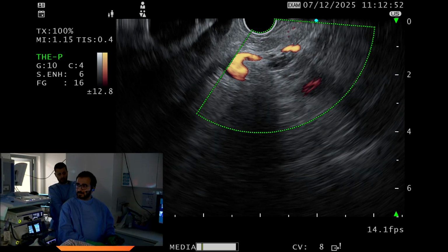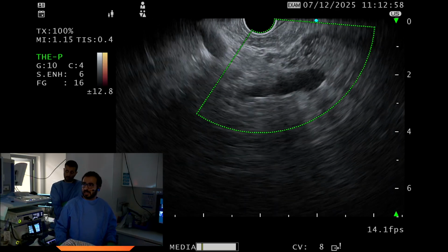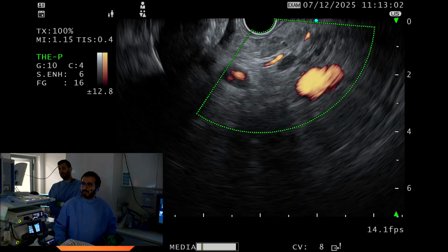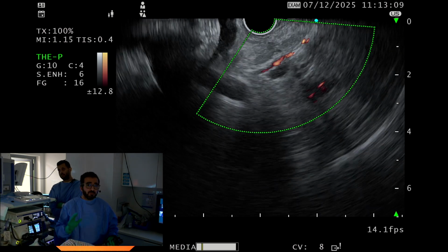Dr. Adel, any comments to respond? Well, I agree. Yeah, totally agree. The only thing is, it looked like serous, but all the history is IPMN. So maybe a trial of FNA, if possible and safe.